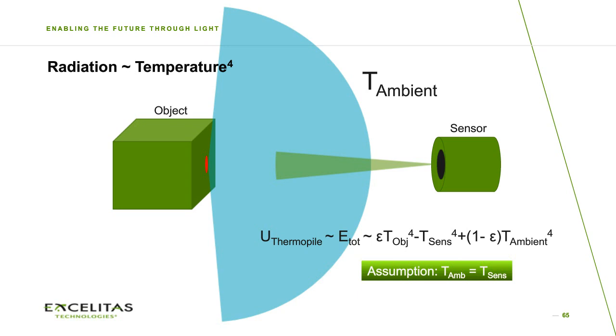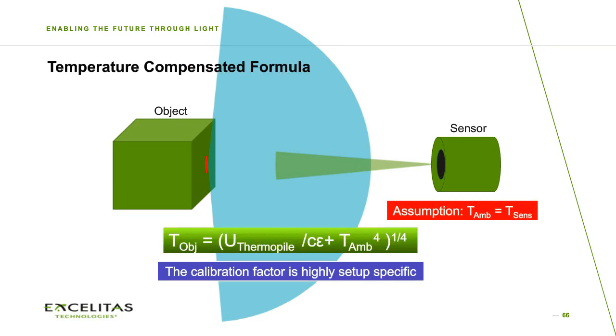So let's take the next one. You can see that this voltage depends, as I said, on the temperature difference, or the net radiation, which you have. So in a case where the object is colder than the sensor, actually you are measuring a negative voltage, because the sensor is cooling down. The inner structure, the membrane, will be colder than the sensor's bulk temperature. So you get a negative one, and then the ambient temperature compensation takes again the value to the right reading.